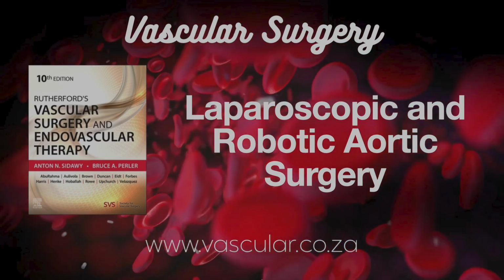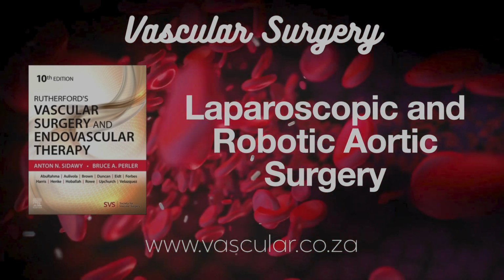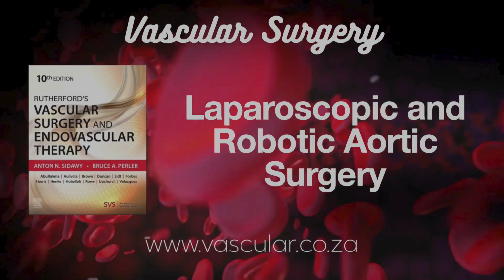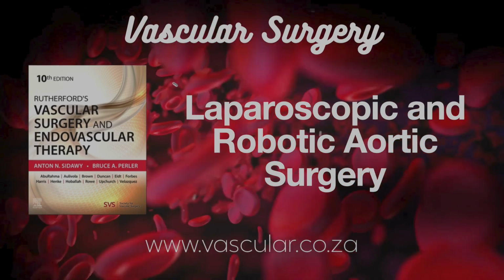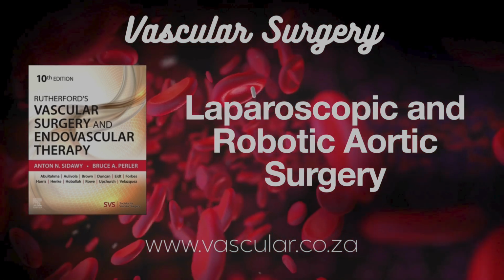Sounds incredibly precise. Any downsides to robotic suturing? The big one is a lack of haptic feedback. Touch. You can't feel the tissues through the robot. Not directly, no. Unlike open or even hand-assisted, surgeons have to compensate by really relying on that amazing visual feedback, learning to feel through the instruments visually. It's a different skill. A trade-off there.